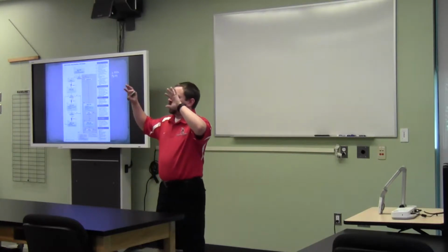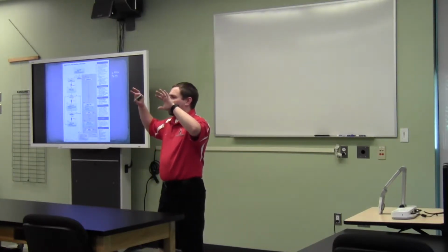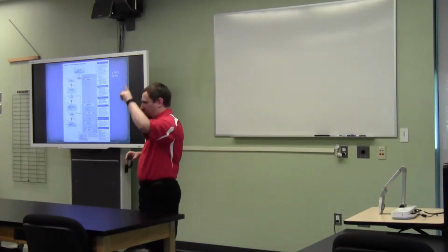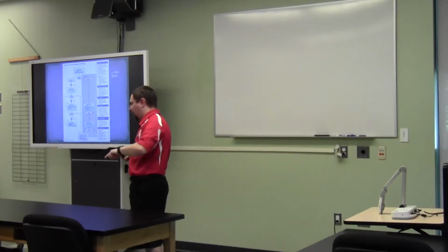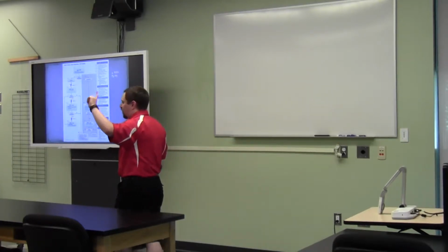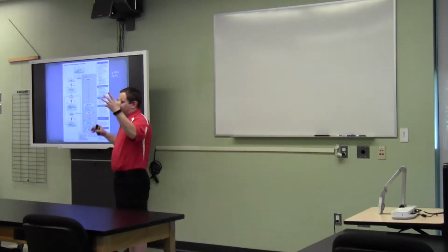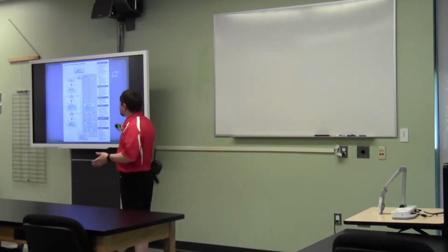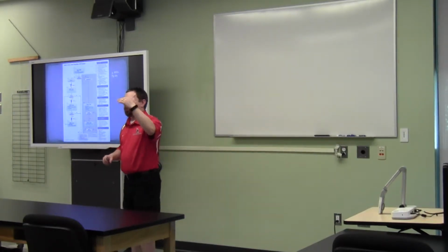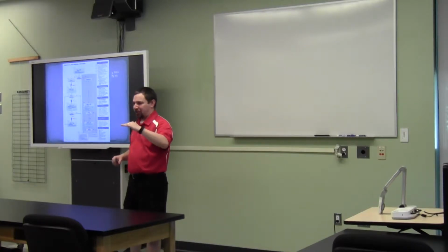So we've all seen the sequencing at the basic life support level, essentially the perpetual circle of chest compressions, ventilations, and AED. You just keep doing that until the patient becomes responsive or EMS arrives, right? On the flip side, as paramedics, our sequence looks a little bit different, and I bring this in to show where we prioritize airway management.